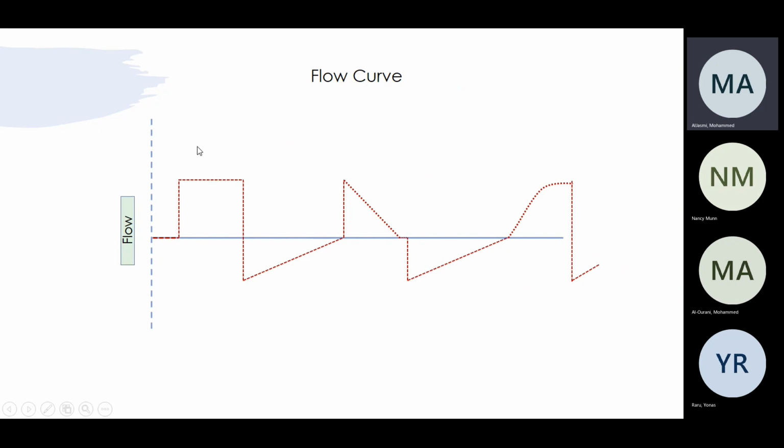So these are the types of curves. We have square, decelerating, accelerating. I've never done accelerating. It's like square or decelerating. Which one is better for someone who has COPD? Let's start with Saddam. Yeah, or asthma. Good. Anyone else?